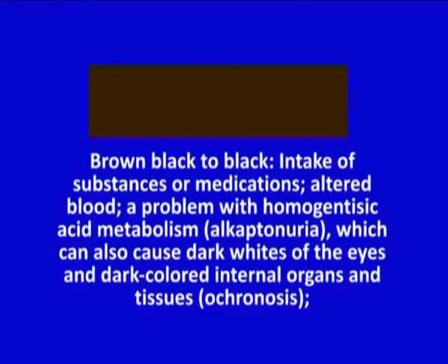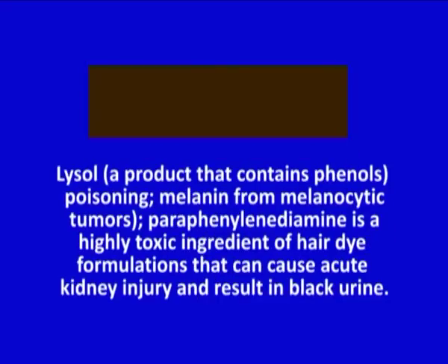Brown black to black: intake of substances or medications, altered blood, or a problem with homogentisic acid metabolism, that is alkaptonuria, which can also cause dark whites of the eyes and dark colored internal organs and tissues, called ochronosis. Lysol, a product that contains phenols, poisoning. Melanin from melanocytic tumors.